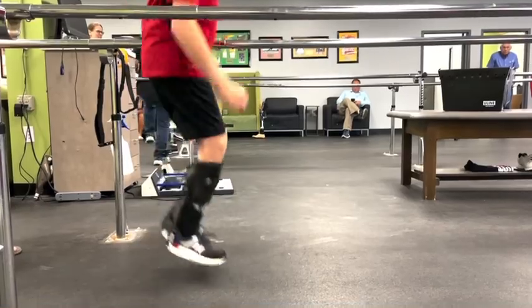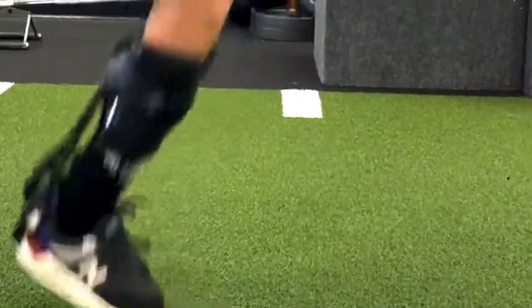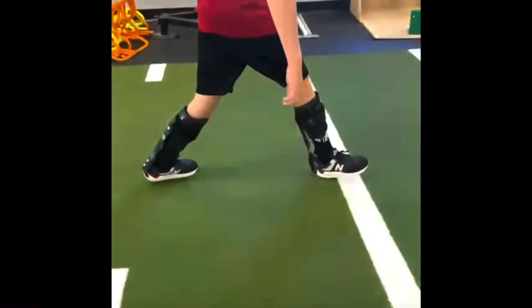Now he can even do repetitive jumps. And this is, once again, he has zero motion in his ankle.